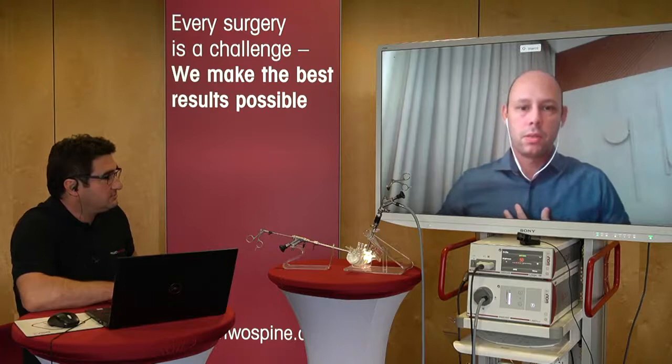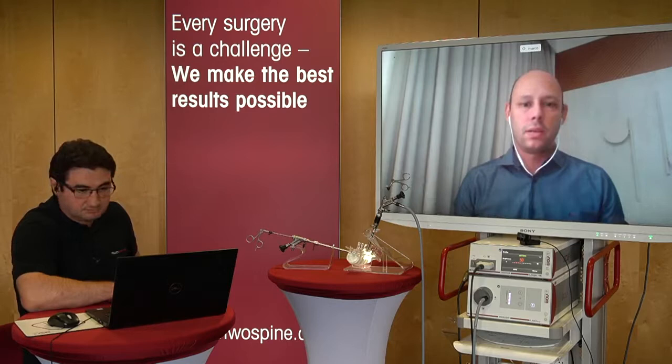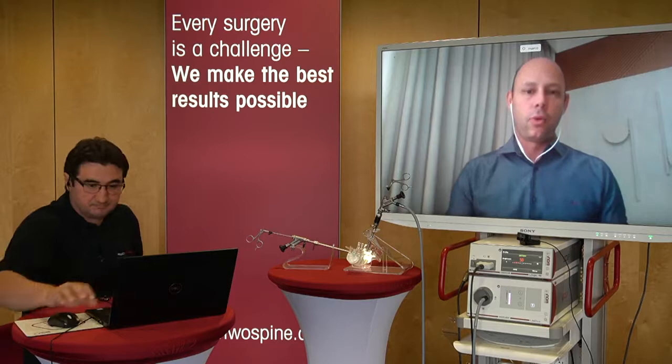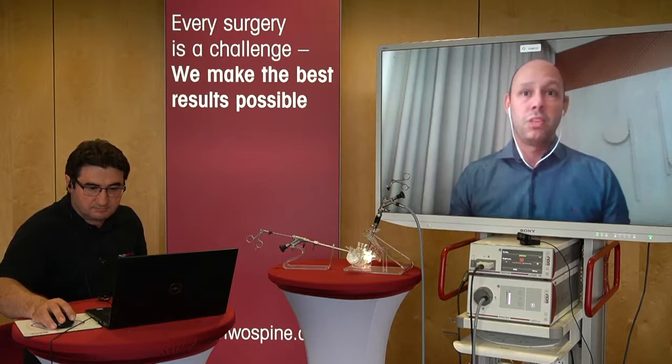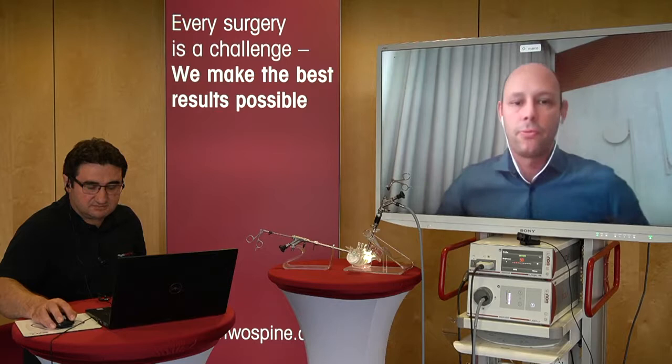Okay, another question. What is your percentage with the interlaminar and transforaminal? What is my number of cases, the percentage of transforaminal? Oh, okay. I use the transforaminal approach in maybe 20% of my cases. I only perform the transforaminal approach in foraminal or extraforaminal pathologies: foraminal stenosis, disc herniation in the foramen or extraforamen, or disc biopsies, discitis, to treat one discitis maybe. Most of the time, I prefer the interlaminar approach in the lumbar spine. Okay, thank you, Marco.